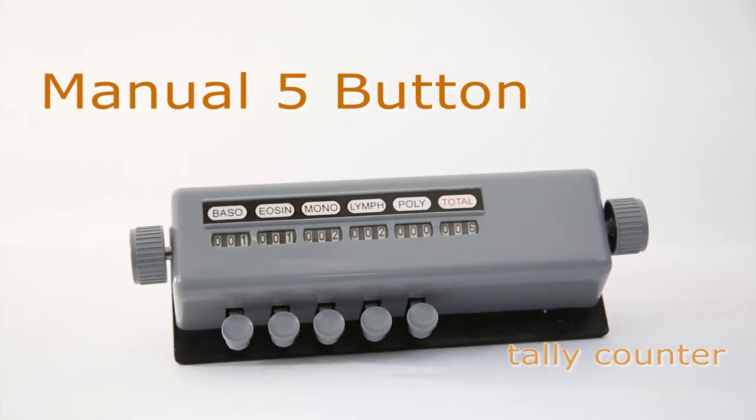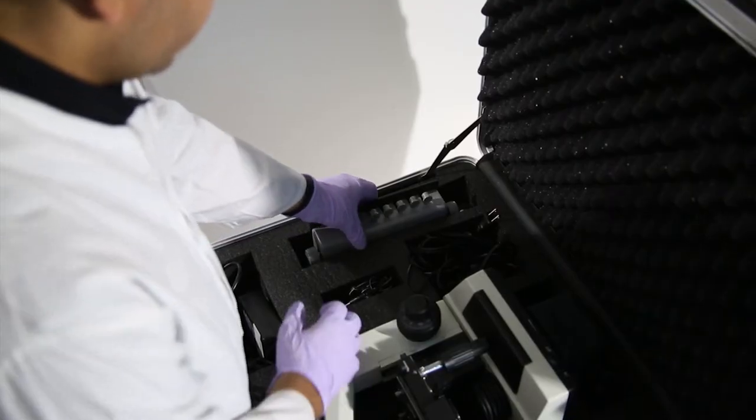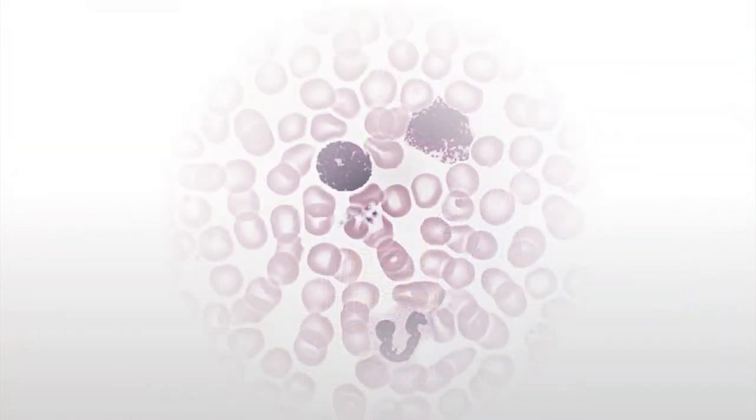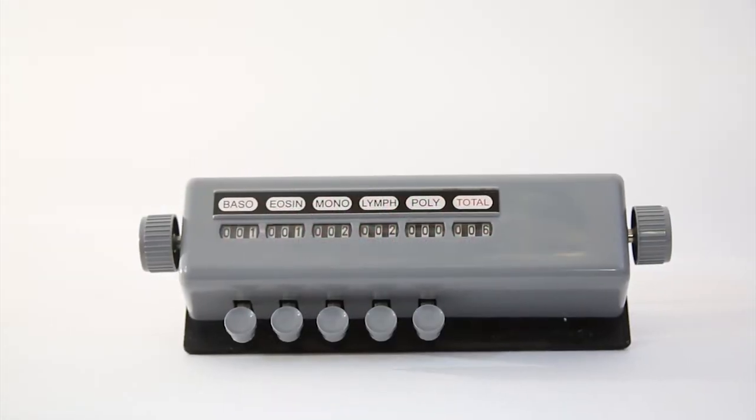Manual 5 Button Tally Counter. The counter is used to differentiate blood cells and record leukocyte quantities as they are identified within hematology. Blood samples examined under a microscope accumulates a subtotal for each type of cell encountered.